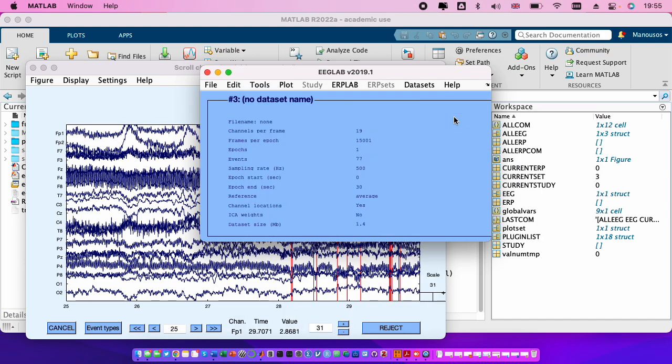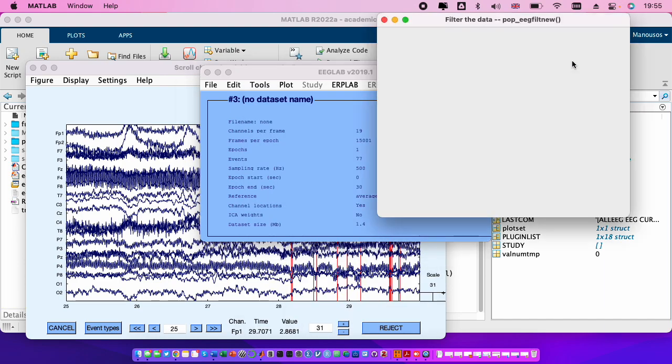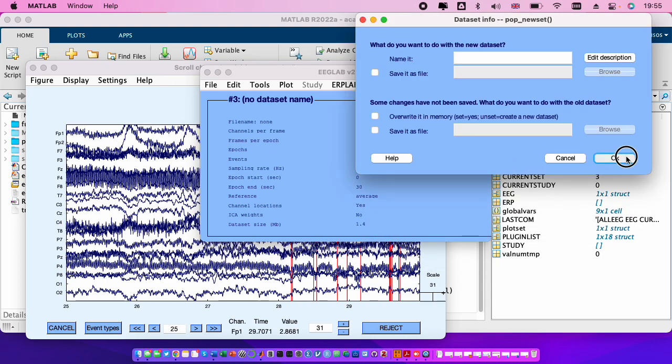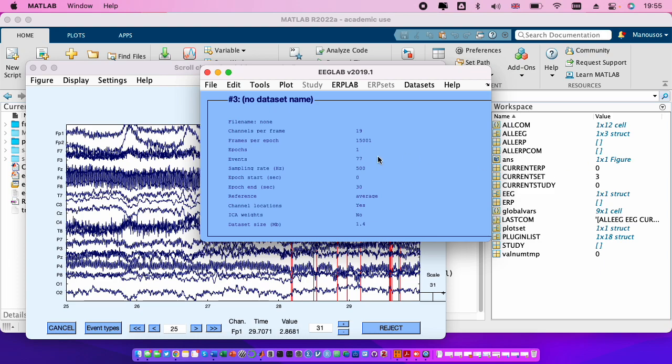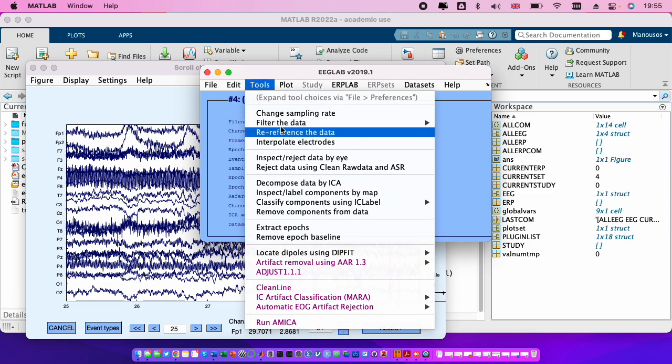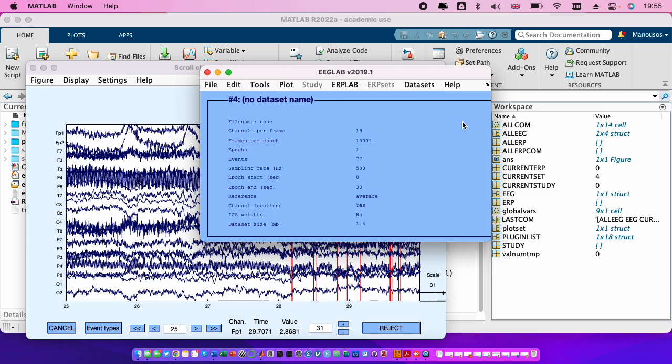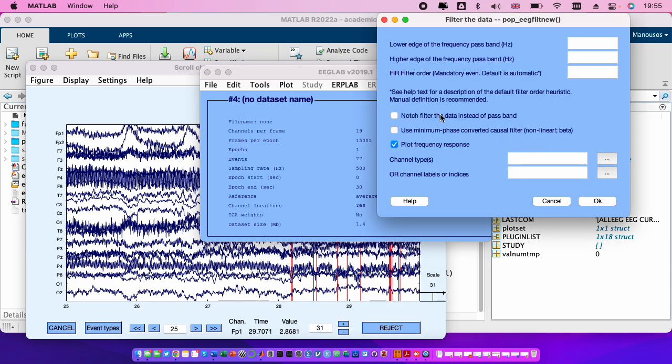Ok, tools, filter the data, basic FIR, 45. Ok, and then we set that for the notch filter in order to remove the 50 hertz we put here 47.